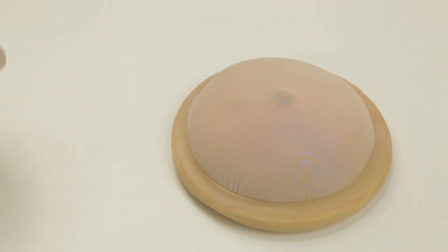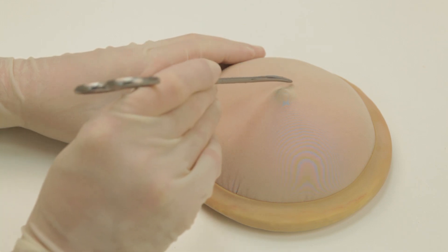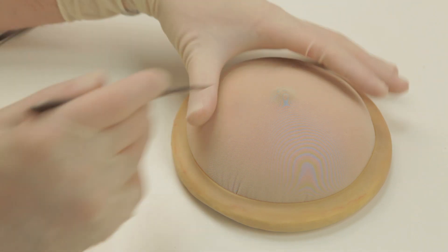Each of these breast simulators contain four lumps, one in each quadrant. Once you have located a lesion, decide on the appropriate incision.